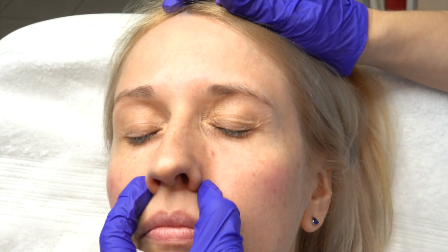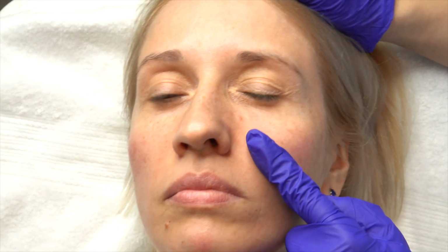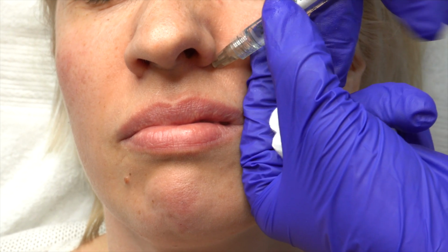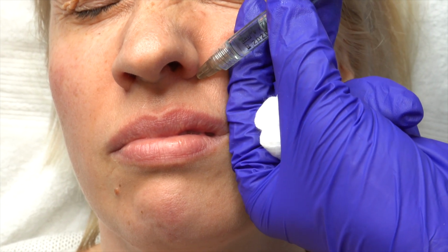Now I'm going here to the base of the nose under the buccomaxillary ligament. You should go down to the bone. Relax. Then you have to do aspiration first.